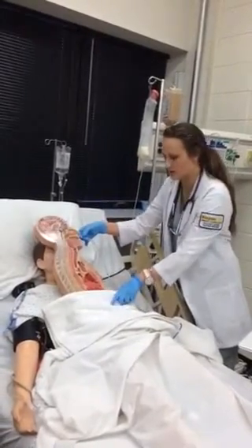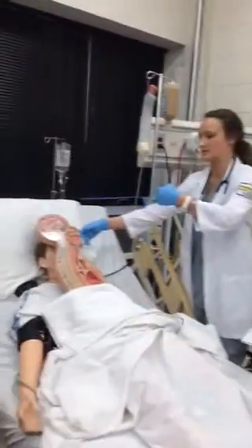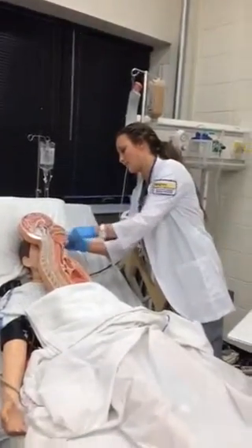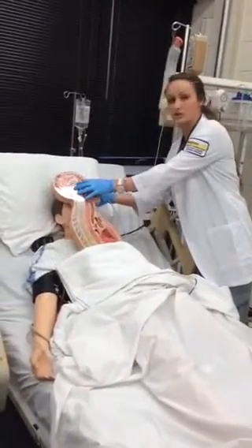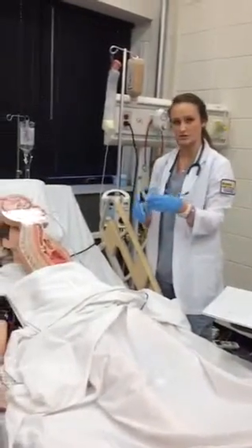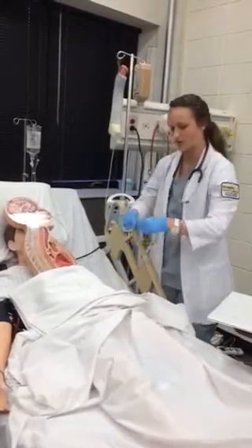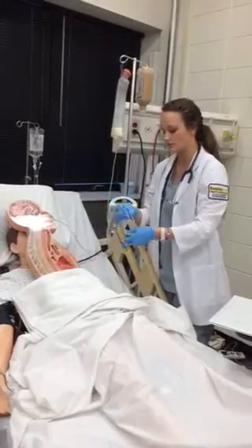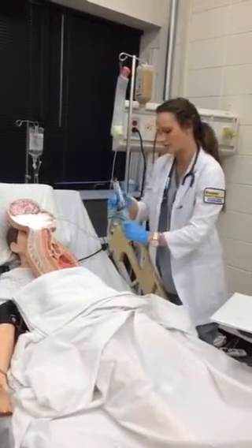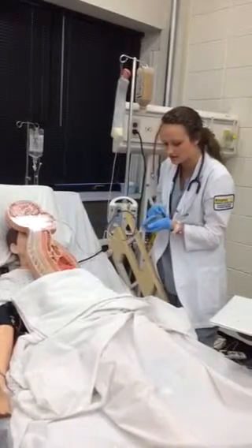All right, so once the tube is in, I'll go ahead and tape it where it needs to be on the nose. Once it's secured, I'll check the placement of the tubing. And for that, I'm going to measure the aspirate. So I would unclamp it if it's clamped, put my syringe on, release this, and pull back about 10 mils of stomach contents.